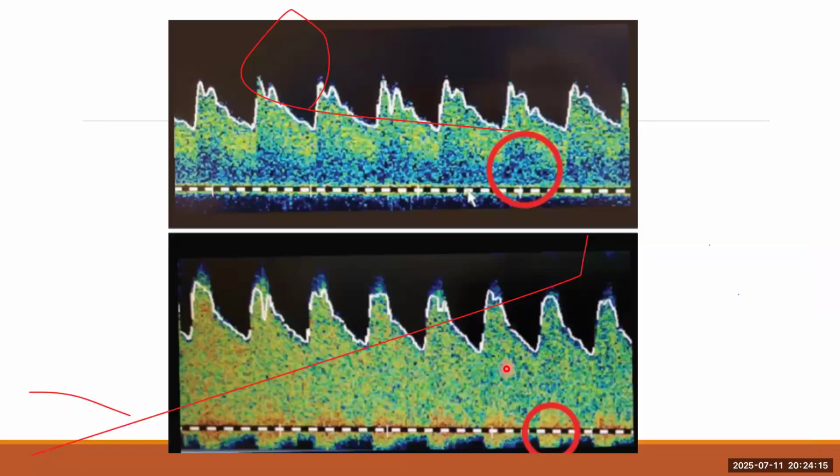So this is again the same thing on the non-imaging Doppler. As we can see here at the base, there is nothing here. This is a laminar flow on the upper part, whereas on the bottom part, there is some noise or a disturbance which is present, which is the turbulence, which is possibly a stenotic lesion which we are insonating.